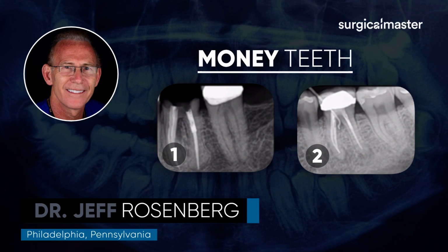And I'm going to talk about both teeth in two videos and talk a little bit about the analysis of the periapical x-ray and how important it is. And that's basically the only image that I'm going to show. And I wanted to demonstrate how much information you can get from one radiograph and how useful it is in identifying all the challenges prior to the surgical extraction. And I want you all to try this in your practice and spend the time before you perform the procedure and to be really, really prepared.